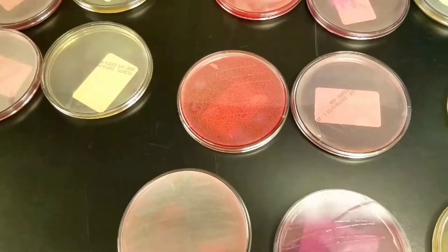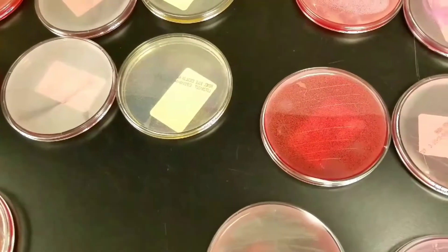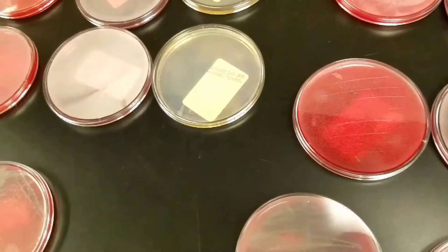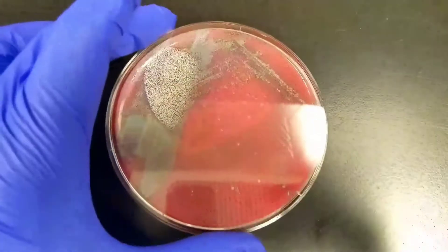Hey guys, it's Mara. In today's video I want to show you guys a bunch of different urine cultures and what their growth looks like, and one strep confirmation culture, so that would be this one.